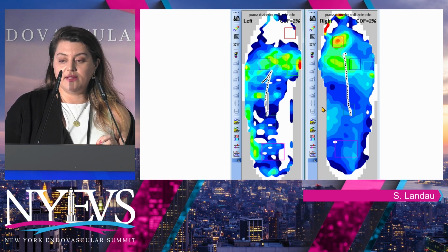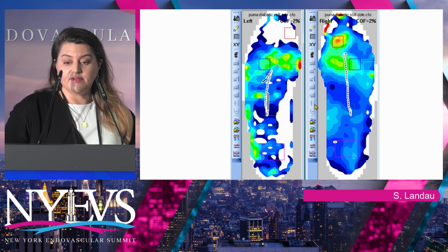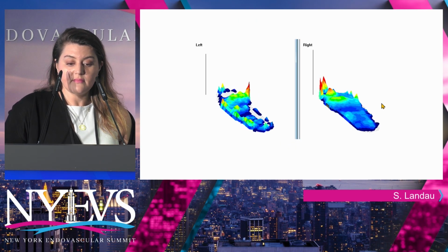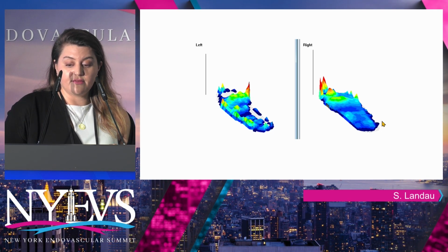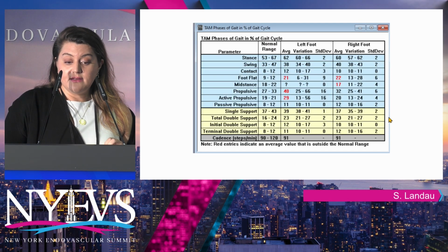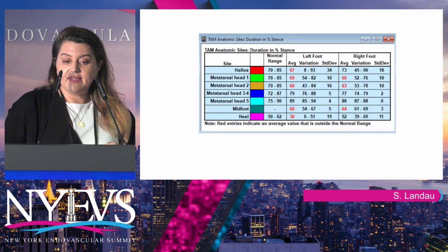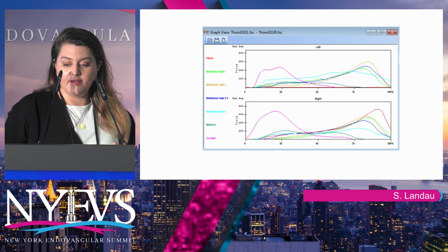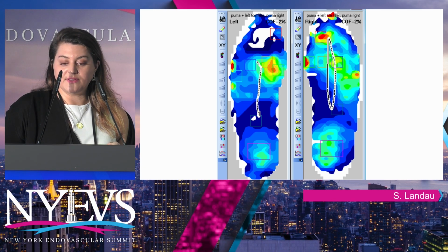So I couldn't change his shoe gear type to increase a forefoot rocker, but this was successful. And his right foot performed better too compared to just the shoe alone. And you can see here everything was neutralized. This is a nice sea of blue, especially on the right as well compared to the shoe. So these had the best numbers for him, and that's the goal. In terms of heal time, it's sort of hard when you have an amputation to get it one-for-one, but he definitely performed the best. So just for fun, I walked him with the toe filler as well.